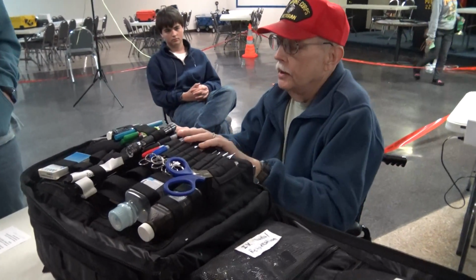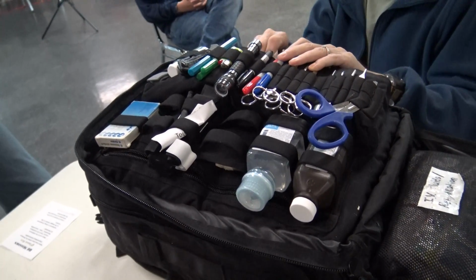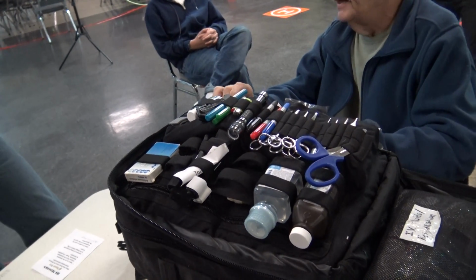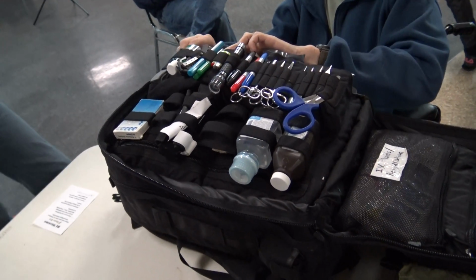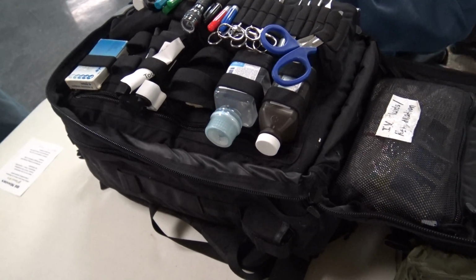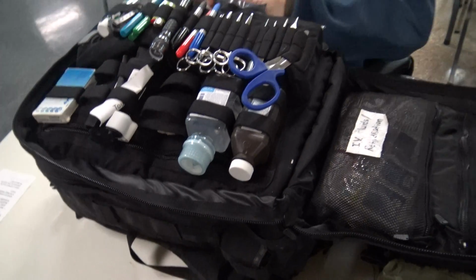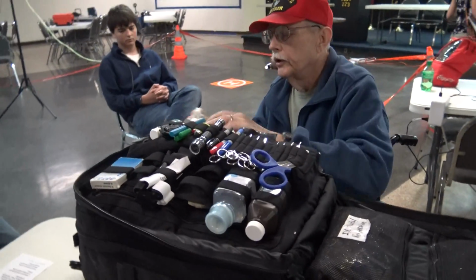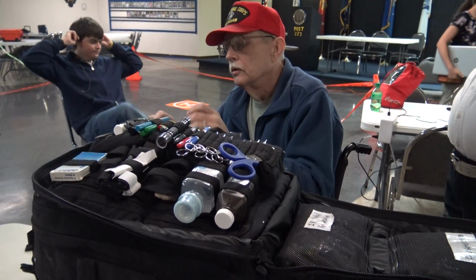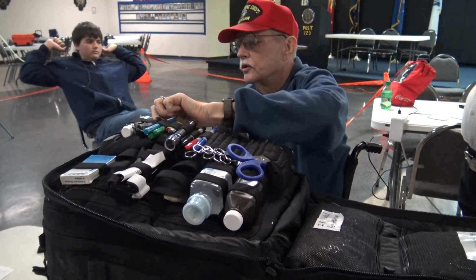We also keep in here Kerlix gauze because they work great for cleaning up messes and bandaging up less minor things. We've got, these are regular compressed battle dressings. These are what they call the H&H compressed dressings, which are outstanding for serious cuts and things like this.